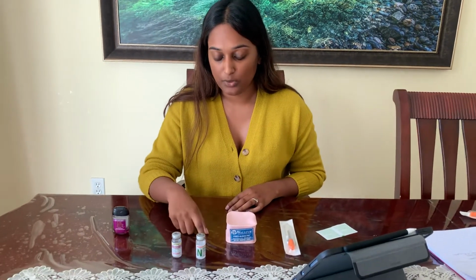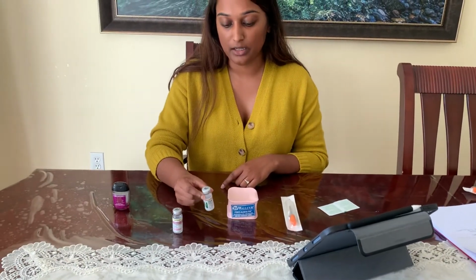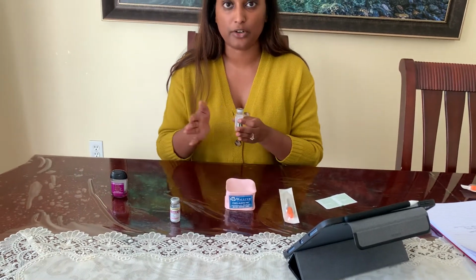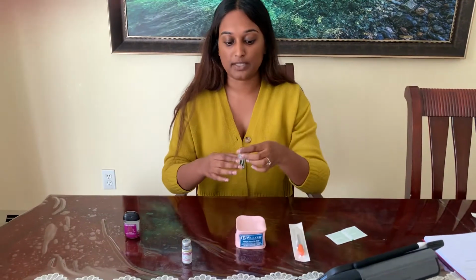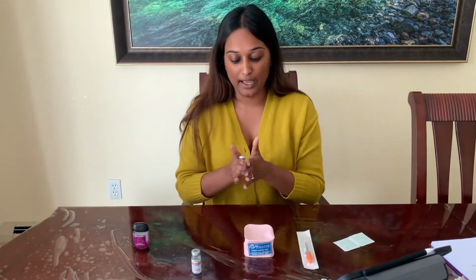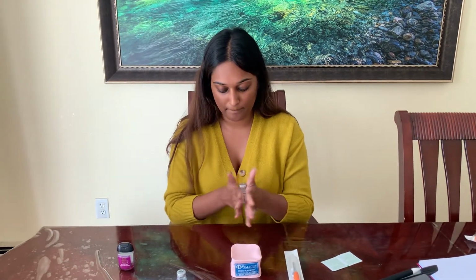One thing to note is that for the NPH insulin, it's important that you roll the insulin between your hands to make sure the medication is resuspended, because as you can see, all the white particles, the sediments, are sitting at the bottom of the vial, so you have to make sure it's resuspended prior to administering. So I'm going to go ahead and do that. I'm just doing it gently.